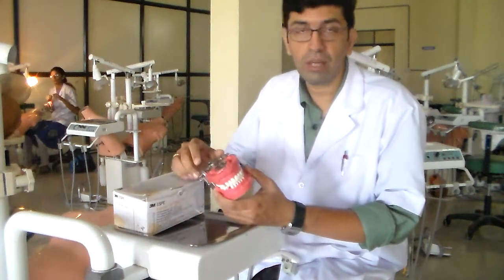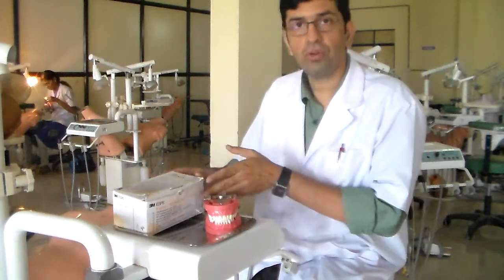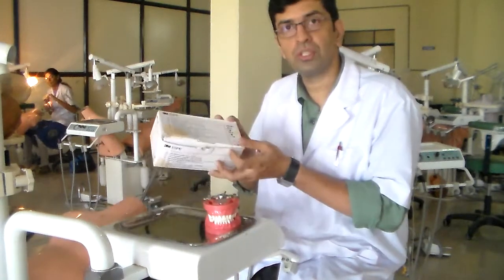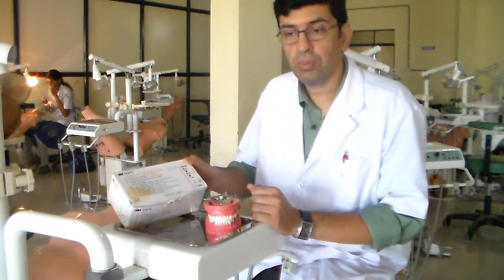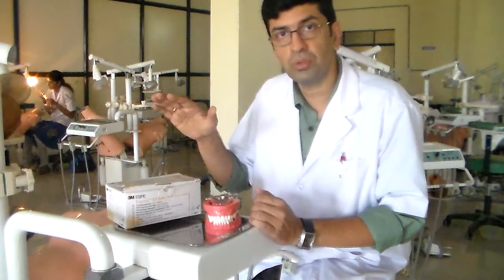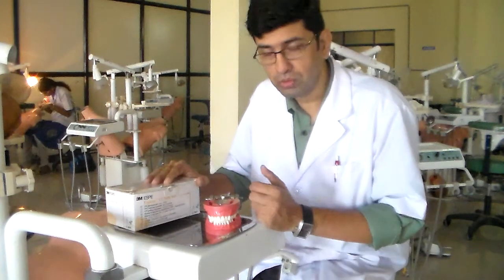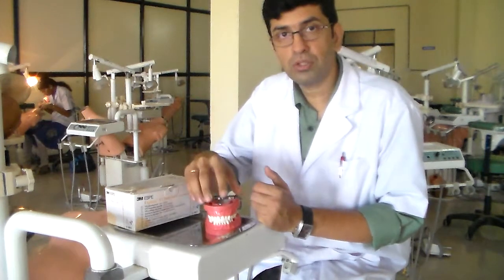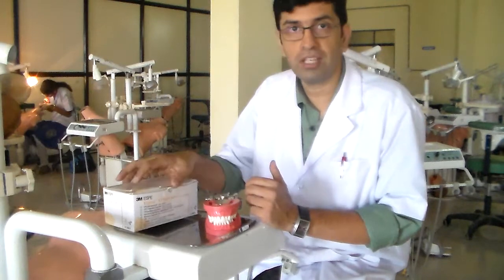I'm going to do an all-ceramic technique preparation today on Typodont teeth. Before that, I'm going to use some Xpress XT putty soft material to make a jig, so that you can verify how it is done. This is for beginners, so I'm doing it in a Typodont lab. I'm going to use a micromotor as well, so it's going to be a bit slow. As you prepare, I want you to have an idea of how much you've done, how much reduction has been completed, and how much more you need to do to get proper preparation.